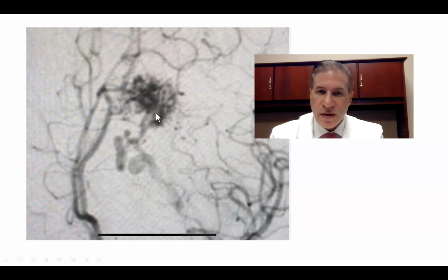is the nidus. And again, because this had bled, this was a young woman, it was a small, deep AVM, we felt that appropriate treatment once she was discharged from the hospital and she was feeling better was gamma knife treatment, 1-day treatment, and super focused outpatient radiation treatment.